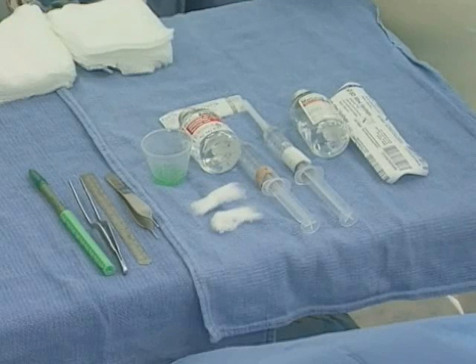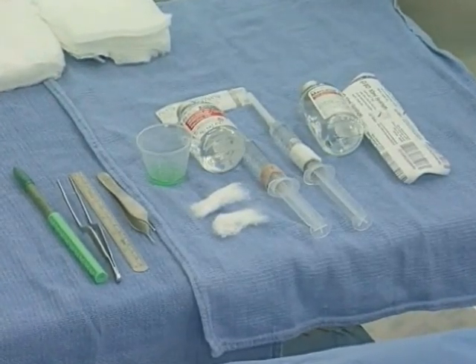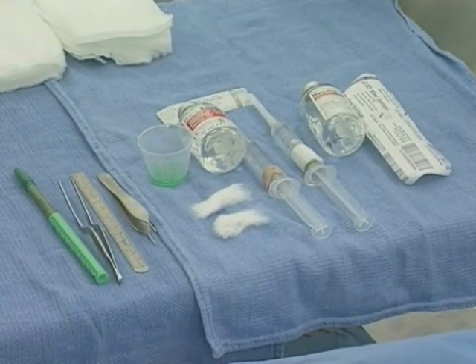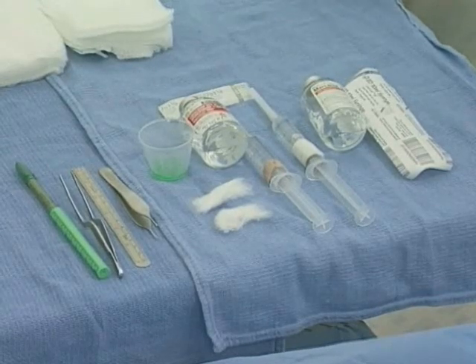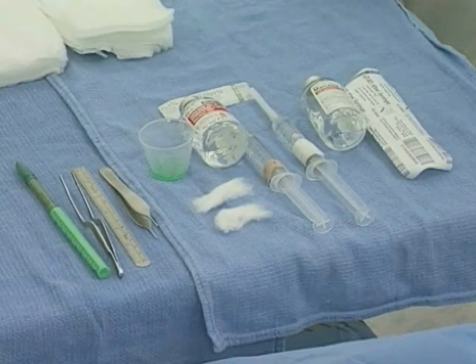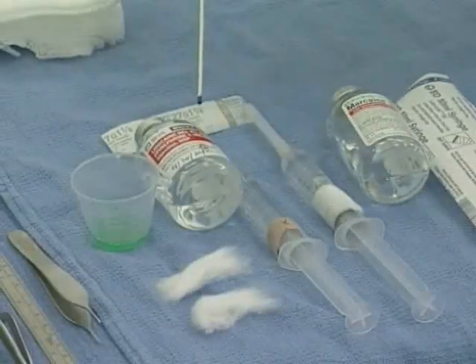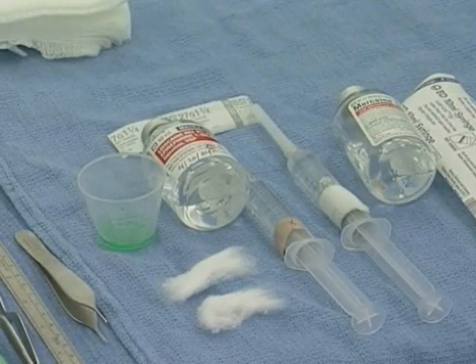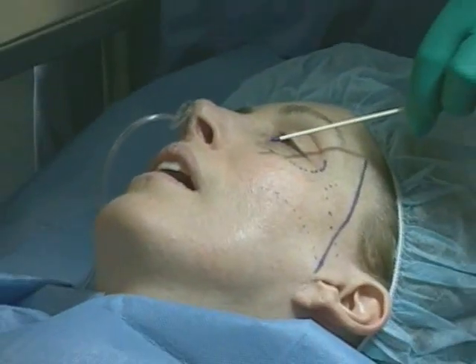This is the local anesthetic that we'll use. We usually do these procedures under a MAC anesthesia. Oftentimes people can do this under just a local infiltration, but we prefer to use the MAC anesthesia. Local anesthesia is important for vasoconstriction and also for the prolonged analgesic effect. We'll inject xylocaine 1% with 1/100,000th adrenaline in the entire area over the maxilla, much like one would do if they were doing a Caldwell-Luck procedure. It also anesthetizes the infraorbital nerve.